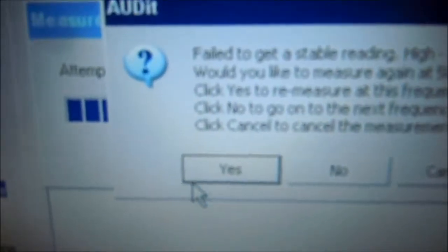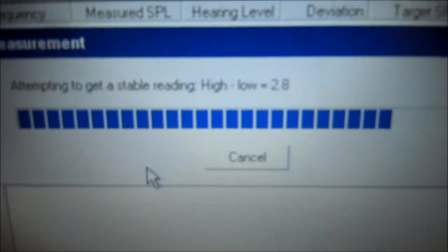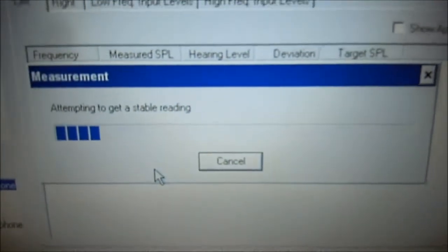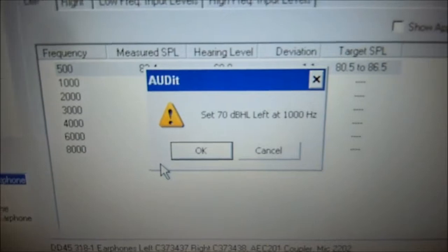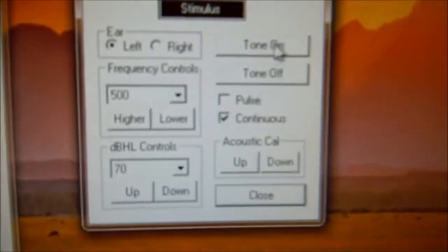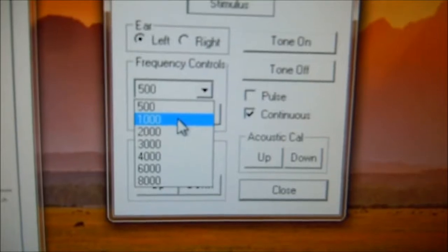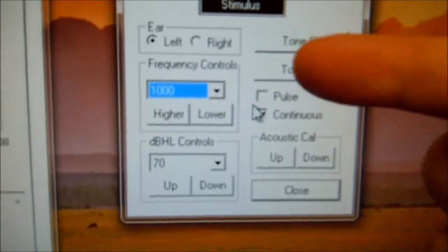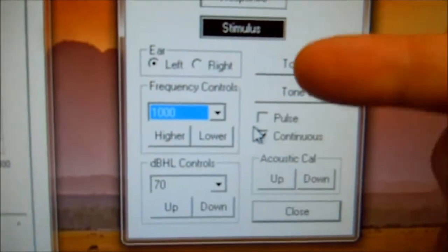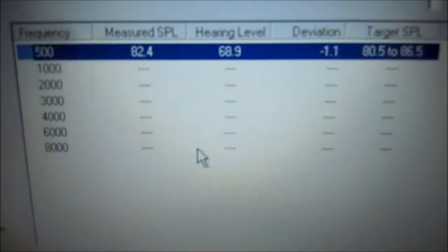So now we come back to the audit software. We click yes to re-measure. It's going to re-measure it. Now it says set the audiometer to 70 dB at 1,000 Hz. So we come back here, select the frequency to 1,000. It's at 1,000 at 70 dB. Tone's still on. Come back to the audit software and we click OK.